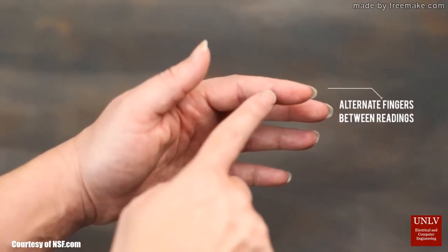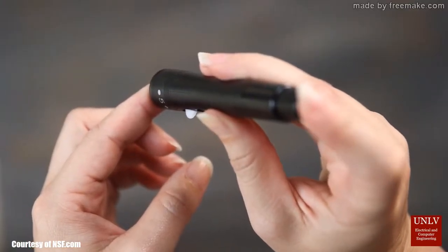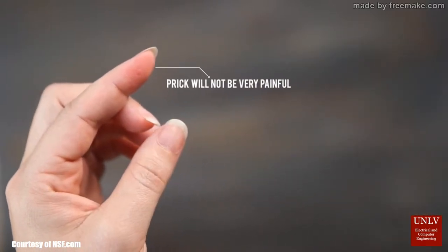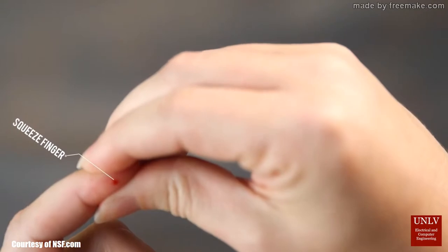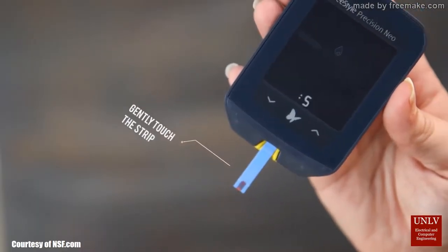Oh man, the blood. There are hundreds of devices in the market as we speak and none of them offer a solution to one of the most important aspects of blood glucose testing: how can we make the pain associated with testing go away?